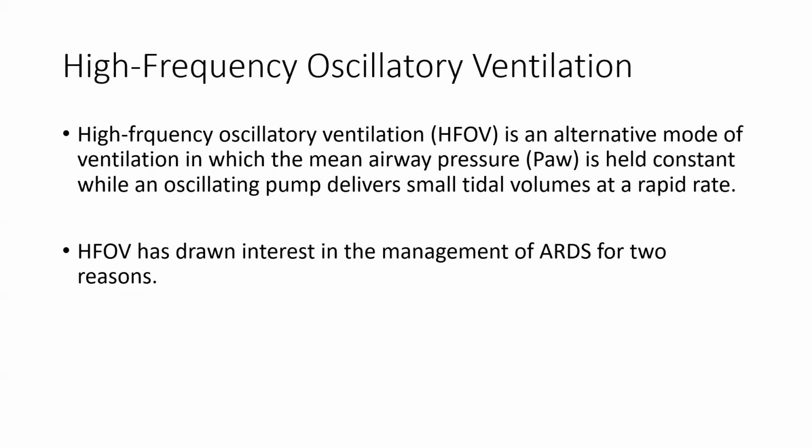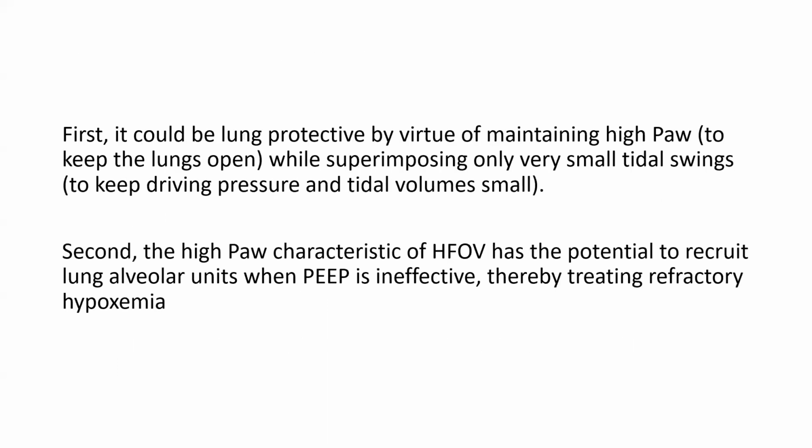Now the next is high frequency oscillatory ventilation. High frequency oscillatory ventilation is an alternative mode of ventilation in which mean airway pressure is held constant while an oscillating pump delivers small tidal volumes at a rapid rate. High frequency oscillatory ventilation has drawn interest in the management of ARDS for two reasons.